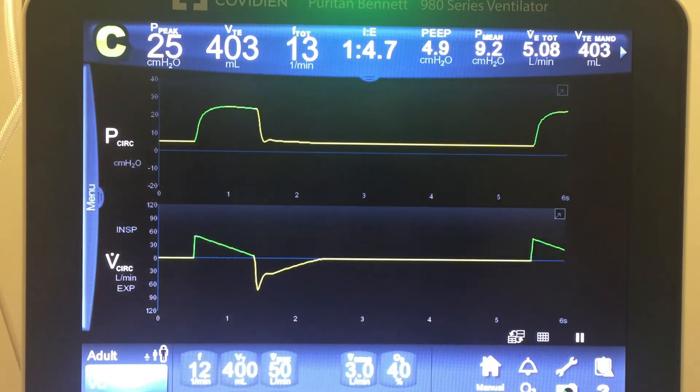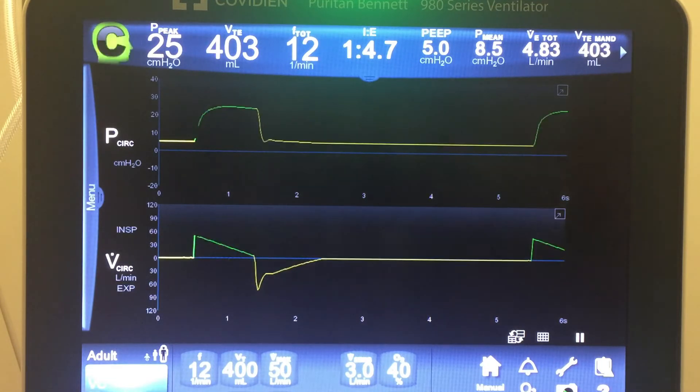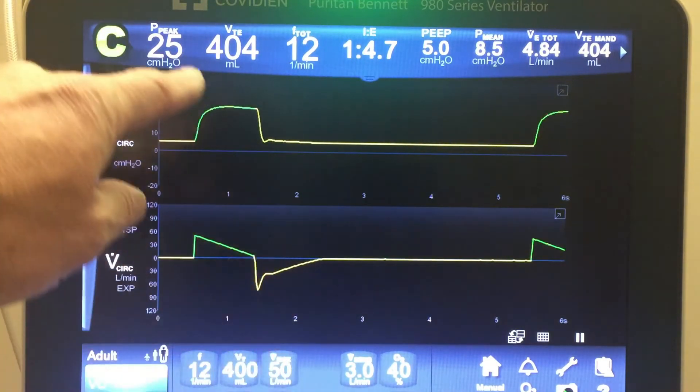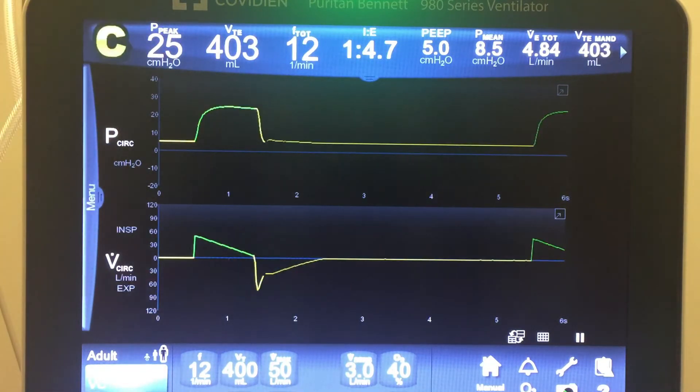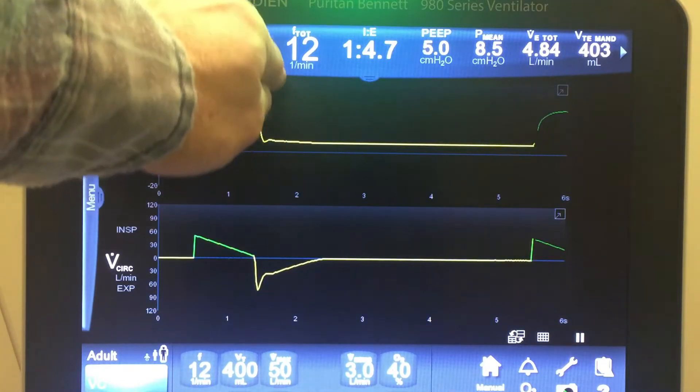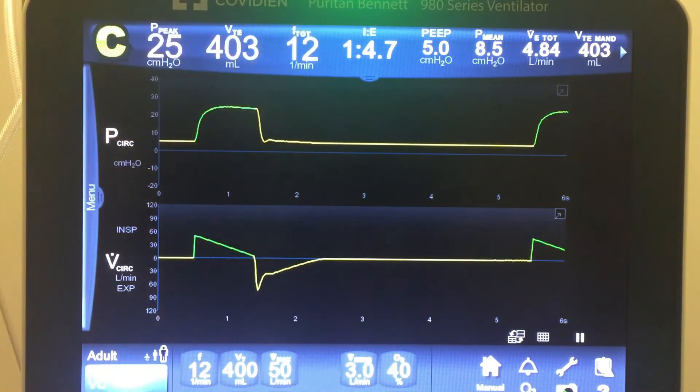Another thing about regular volume control: the peak inspiratory flow is set at 50 liters per minute. When a breath is delivered it will be at 50 L/min, and if the patient wants to pull more than 50 liters per minute, they cannot. So in this mode patients can get air hungry from not being able to pull as much flow as they want. I'm going to demonstrate that — pulling flow very fast — and you'll see the pressure actually gets pulled down, creating a scoop in the pressure-time waveform.